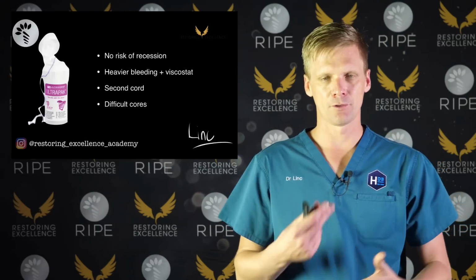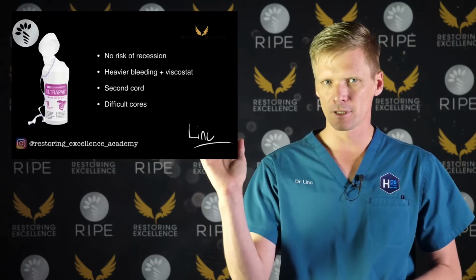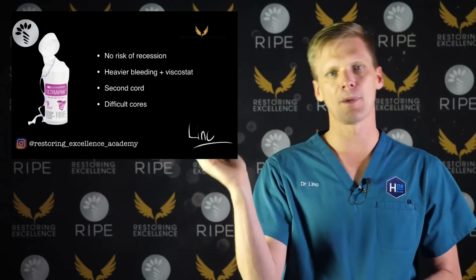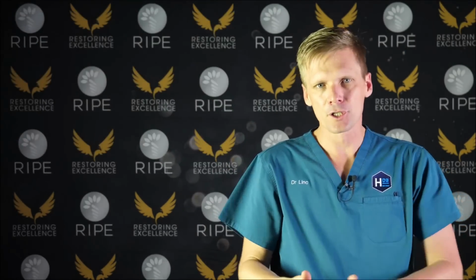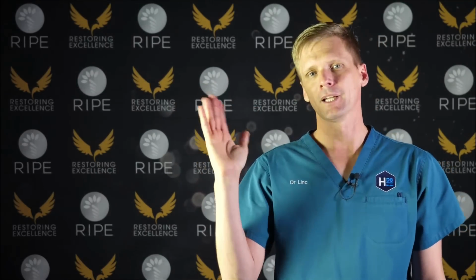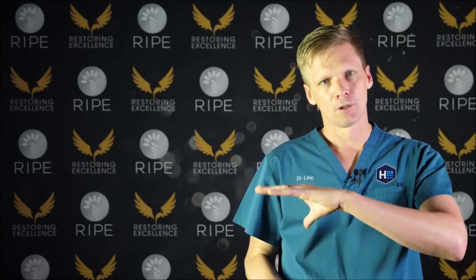So you need the extra retraction, and occasionally, sometimes on the distal of sevens, the second molars, the distal gingiva wants to fall over the margin. It's so tall, unless you have perio surgery first to remove a big distal wedge, that tissue sits up higher than the margin. The tissue is not necessarily unhealthy, but it's tall and it will fall over the margin as you remove the cord.